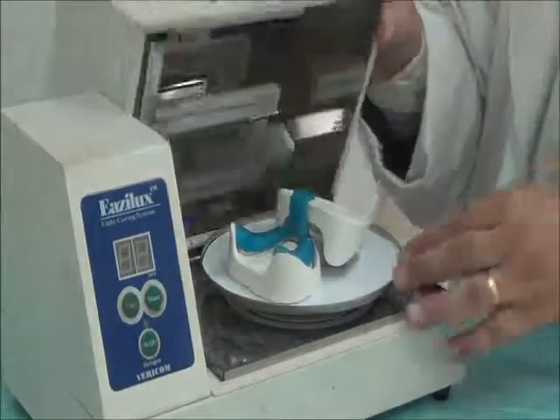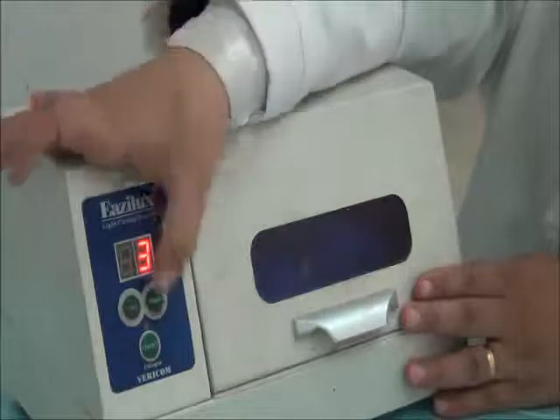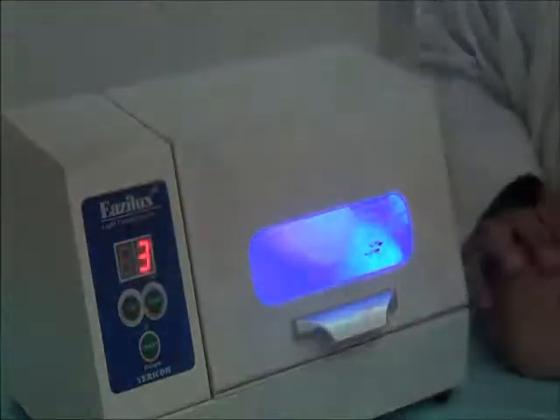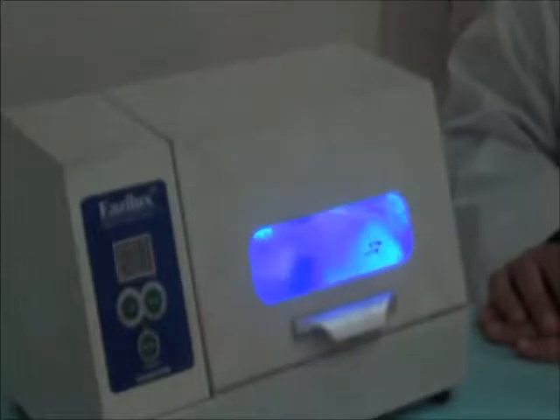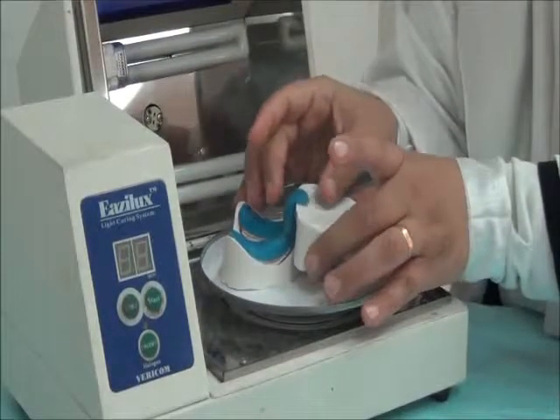We do an initial cure. We could wait for 20 seconds or more, and then once they are finished, we can open, interrupt the cycle, and then remove the support.